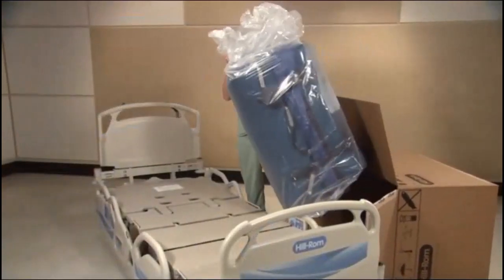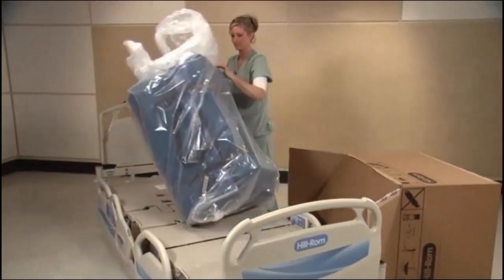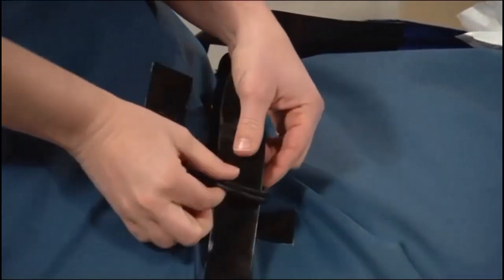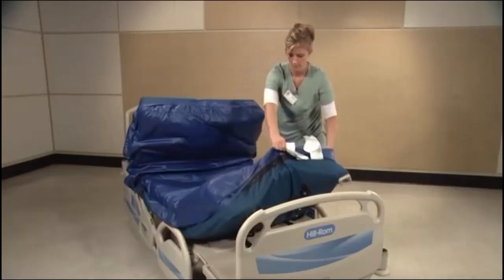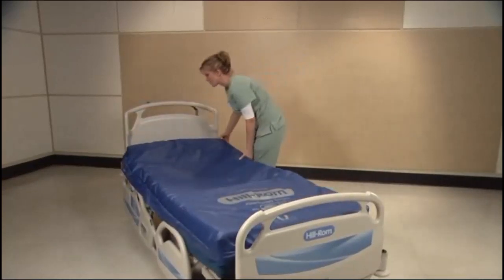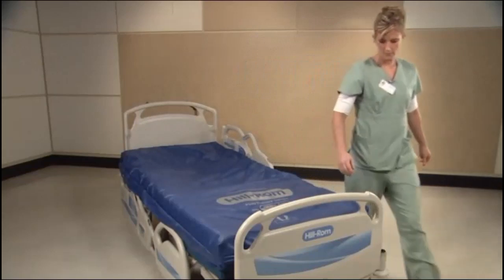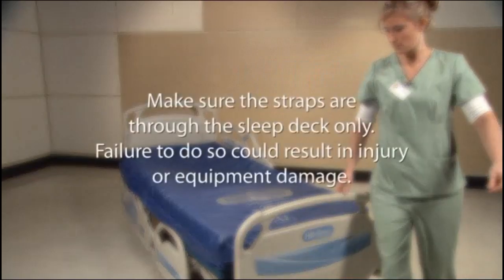Remove the P500 Therapy Surface from the box and place it on the frame. Release the straps and roll out the surface with the hose fitting towards the foot end of the frame. Use the straps and firmly attach them only to the sleep deck on the frame. The straps can be configured in a variety of ways to facilitate various models of frames. Make sure the straps are through the sleep deck only.